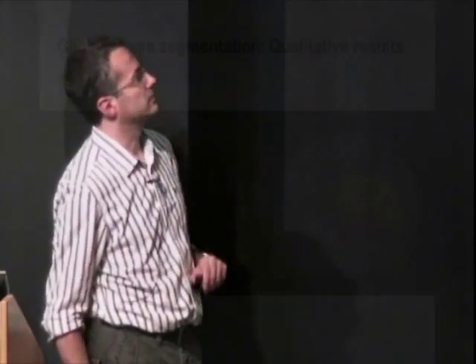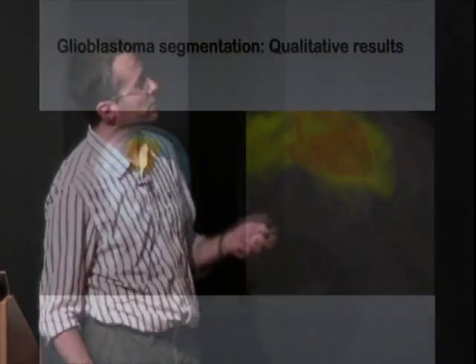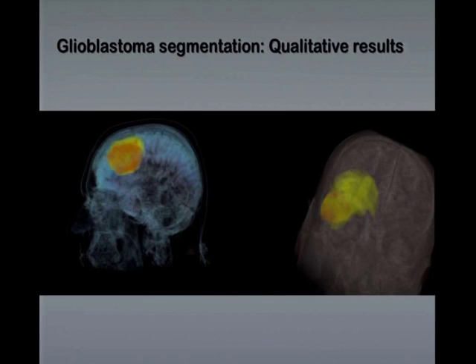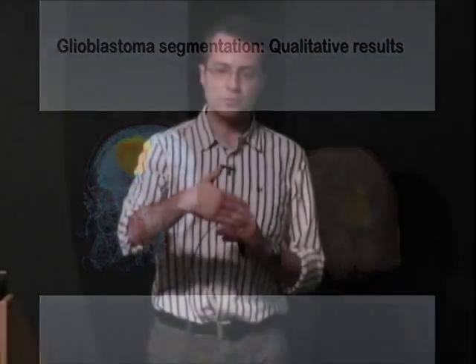These are some pretty pictures, really, some visualizations just to show that it all works in 3D. And again, we have a good understanding of not only the tumor per se, but also the edema. Another reason why figuring out where the edema is matters is that it gives us a good idea of where the tumor is going to spread next if we do nothing.